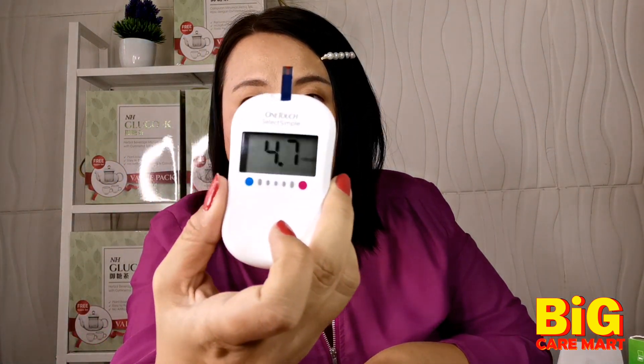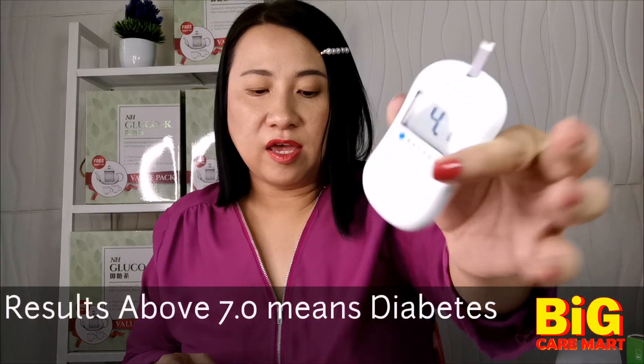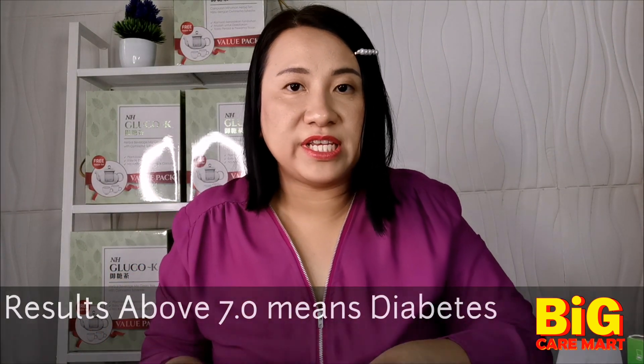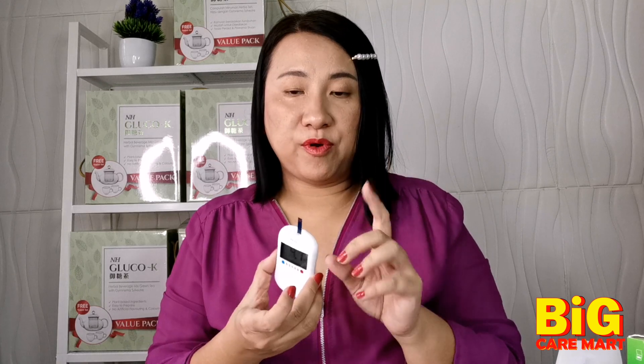The reading comes very fast. My reading is 4.7, which is very healthy. You should be less than six — if you're above seven, you're already diabetic. This One Touch Simple Select has only one memory, but it's a very simple meter, very easy to use.